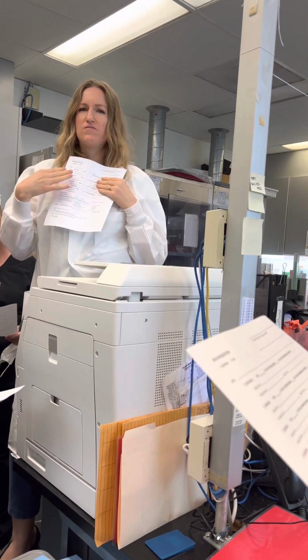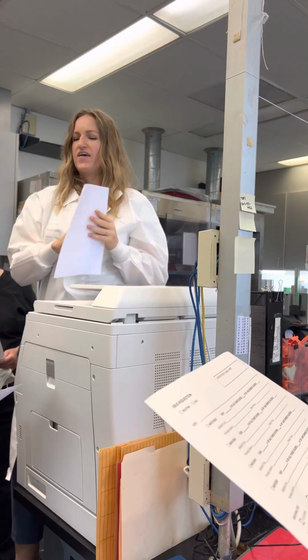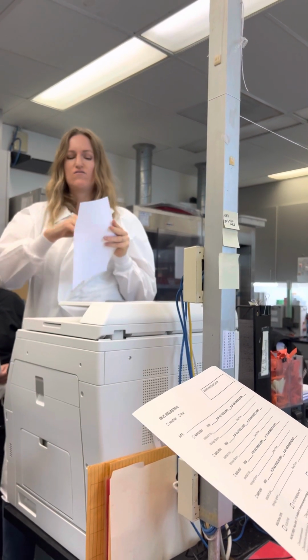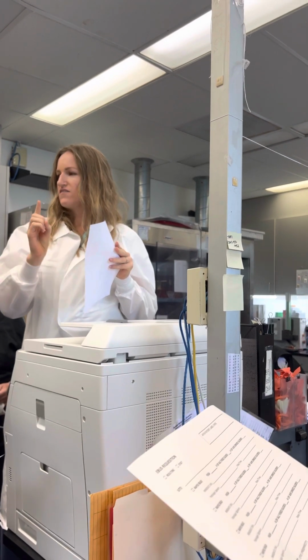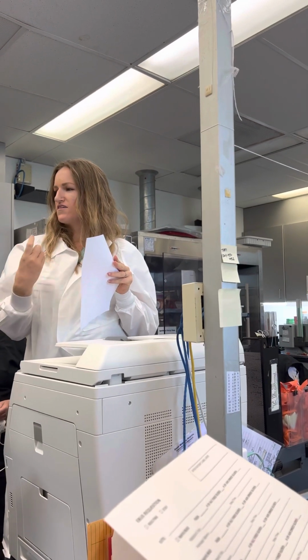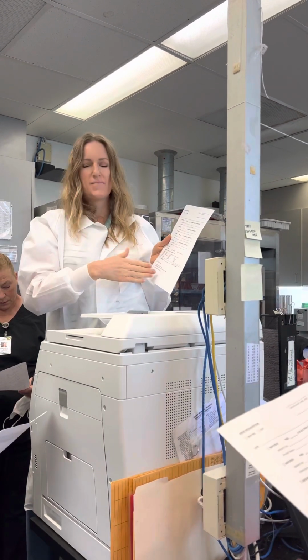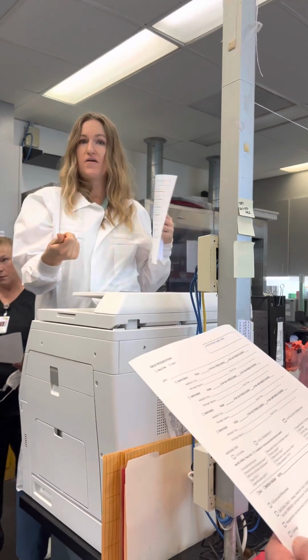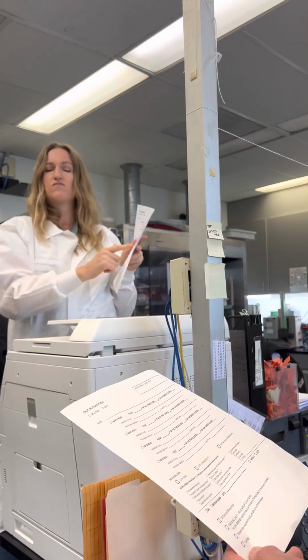We get the paper, we see exactly what tests you want for that specimen, and we can tell right away what containers you sent with it. We're gonna match the labeling with these containers on this paper, making sure every container and slide has the site and the pass numbers, and then we're gonna make sure that the tests that are checked off for it match what you guys sent. So if we see flow and we don't see an RPMI, we're like, okay, wait, did you actually want flow? We're missing an RPMI, or maybe that's a mistake. We can correct those things right away.